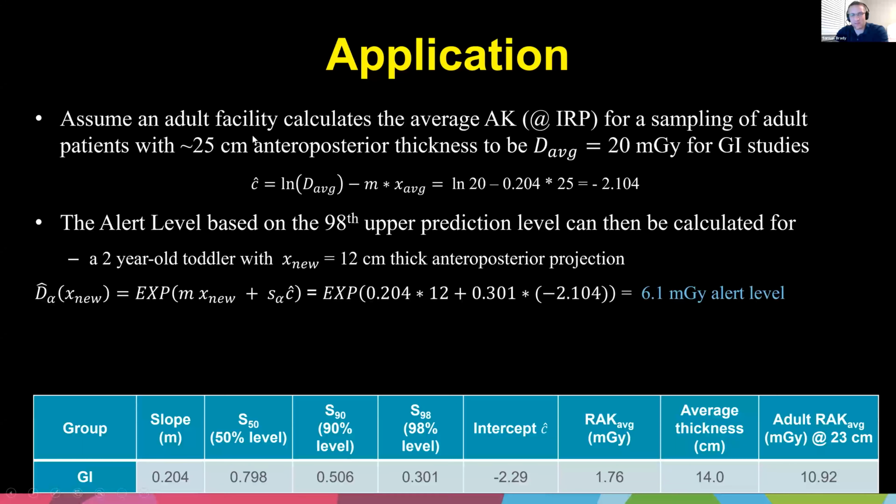Now, this assumes that the dose that you would use on this larger patient will scale for this smaller patient. This is a typical assumption because, as long as the auto exposure is the same on the machine from small to big, you would expect it to scale.